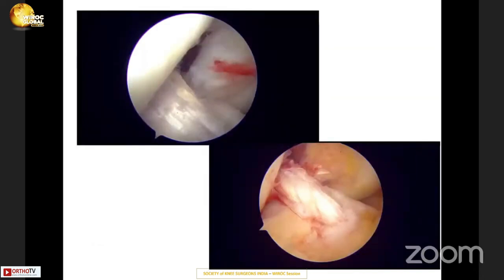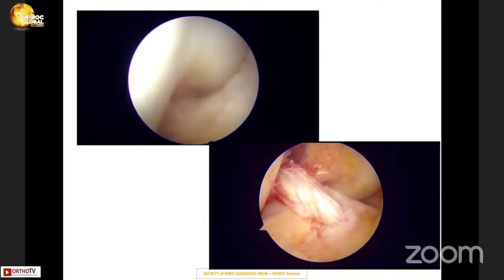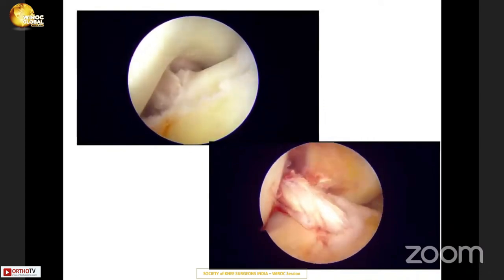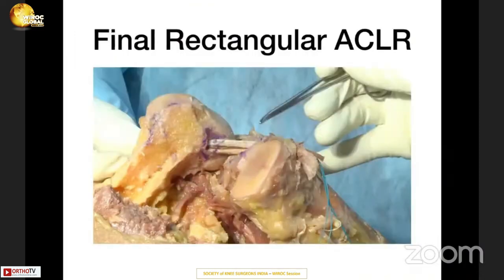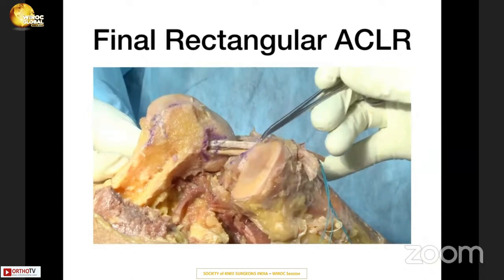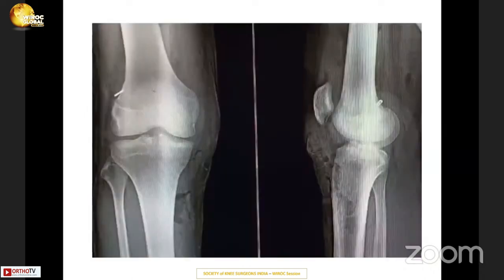Most literature I've seen performs rectangular tunnels only on the femoral side. To my knowledge, nothing has been done on the tibial side — possibly due to concerns about impingement or anterior cortex fracture. However, since we are removing only the posterior aspect of the bone from the tibia, it creates a quite oblique tunnel with no impingement at all after fixation, as demonstrated in the videos showing complete extension. Even on the cadaver, the anteromedial bundle is taut, with the anterior half of the graft going medially and the posterior half laterally — forming a double bundle-like effect. The post-op X-ray shows the tunnel well fixed with screws and an intact cortex.